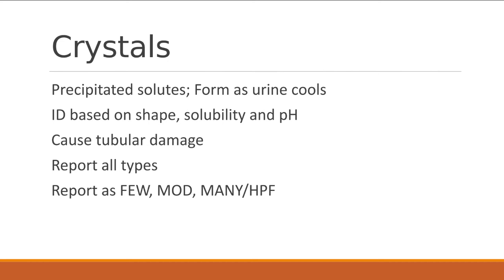They can cause tubular damage. So like I said, some of them are pathological, some are not. There's different things that can contribute to their formation. Any type of change in temperature can also cause crystals. So we'll look at those in a minute. That's important to know too, that there may not have been anything there, but then you change the temperature and it causes crystals. So things like temperature, pH, remember they're pH dependent. If you're on meds or have some kind of weird diet, then those can also cause certain crystals. Or if you have stagnant urine flow, that can also.